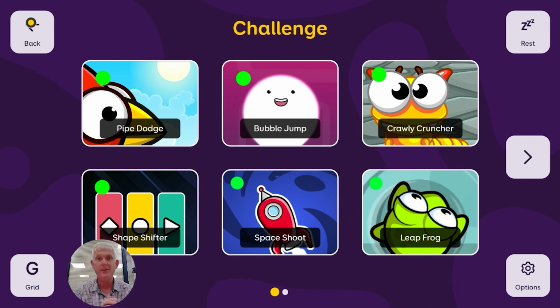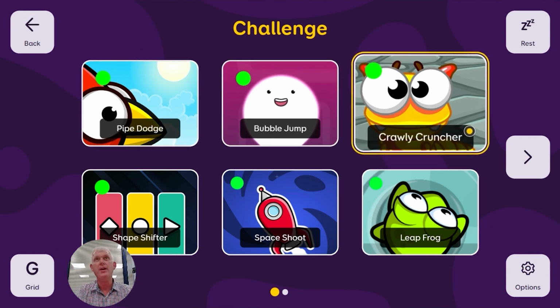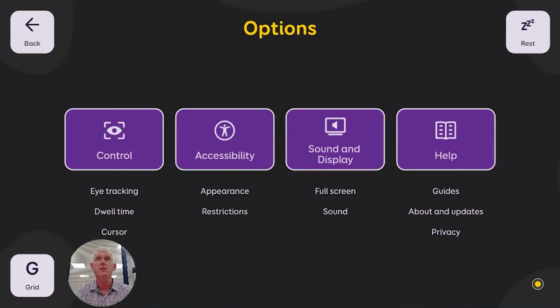And we wanted to think about something where he could explore initially without failing. Just look at the screen, see things happening, and then use these tools and activities to develop opportunities to also practice his communication skills and his choice making. Now, one of the things that would be a step too far at the moment is the idea that he can navigate anywhere he likes. So at the moment, I'm focusing on just eye gaze engagement and using the whole screen.